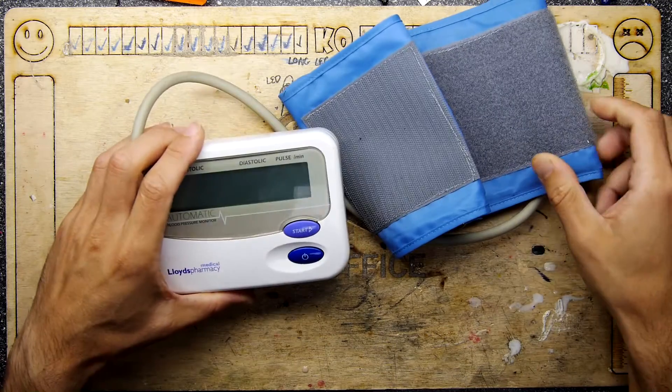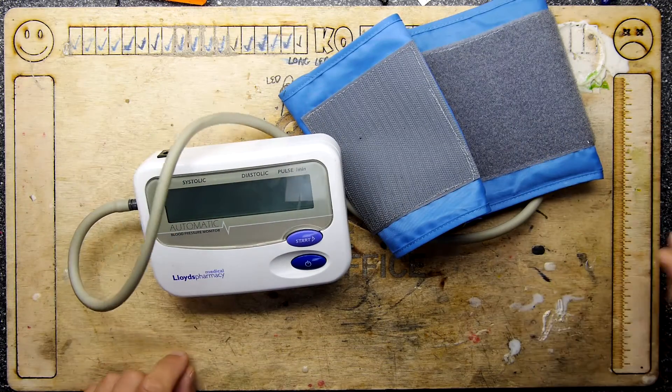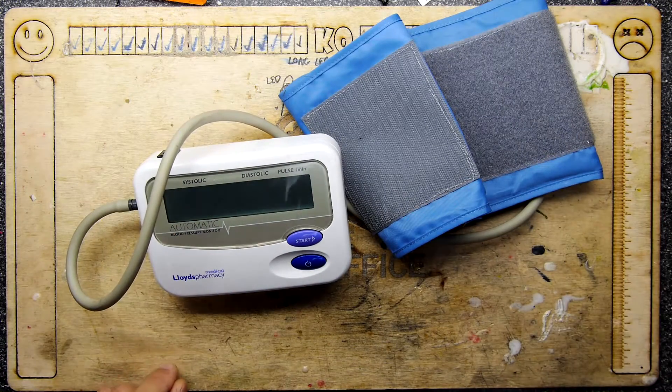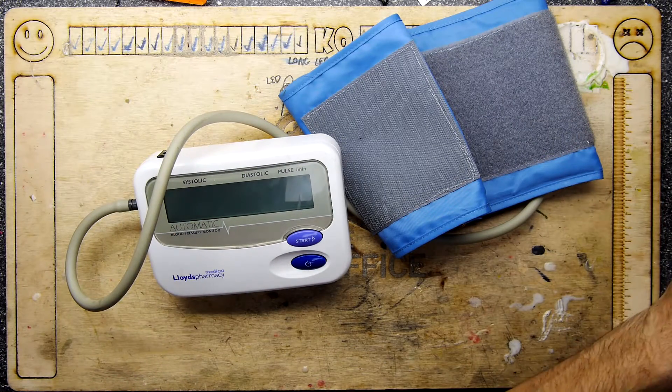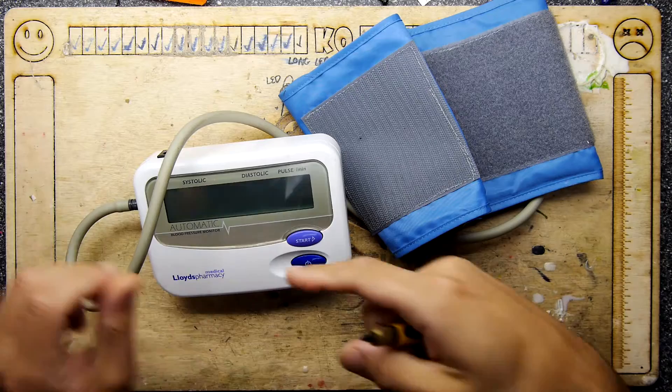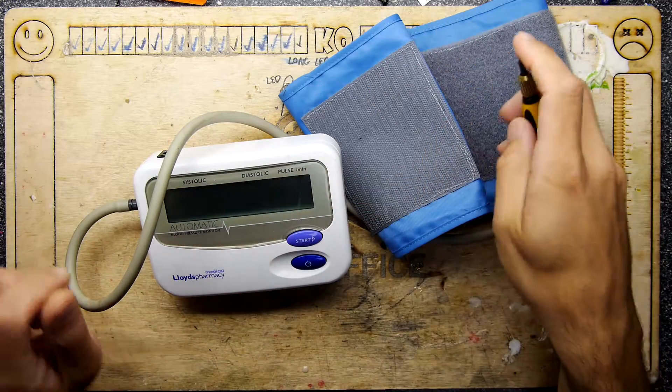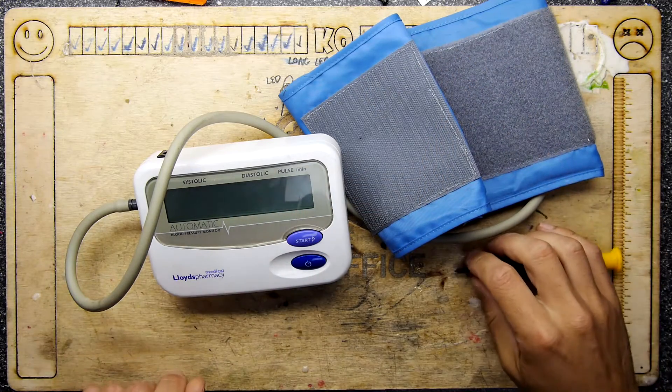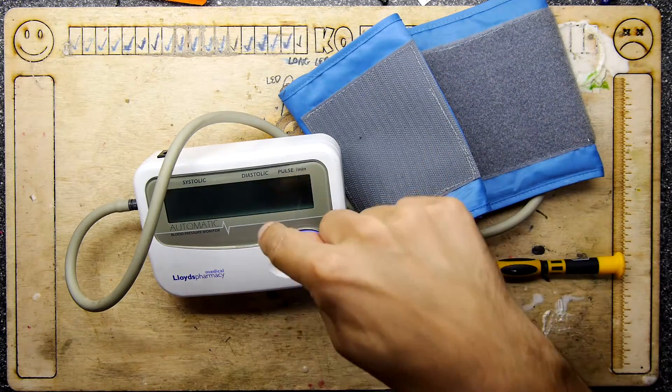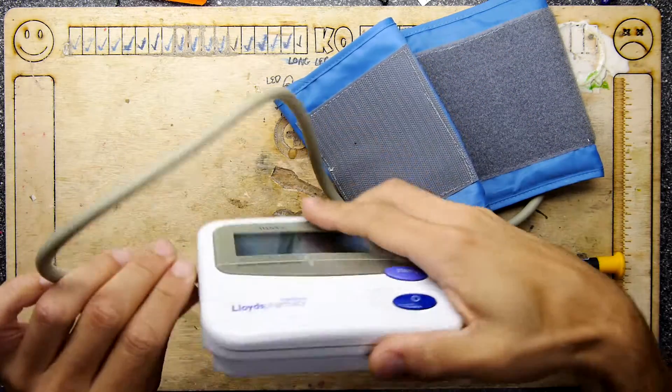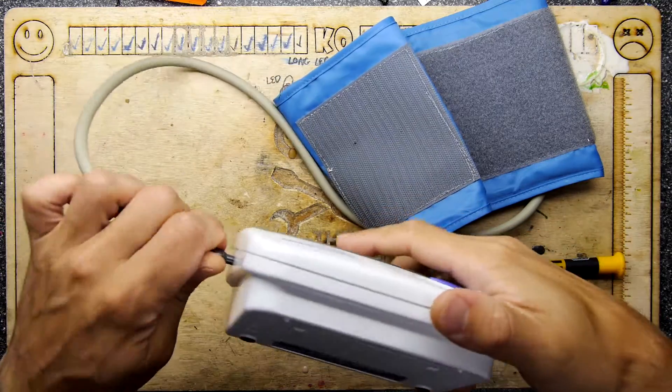Hi I'm Andrew Armstrong and welcome to the back office Teardown Lab. I've been given a pulse thingy. I should restart that. A blood pressure monitor.